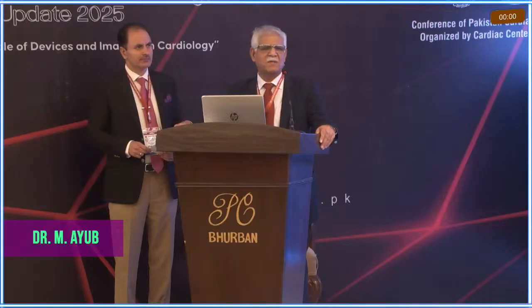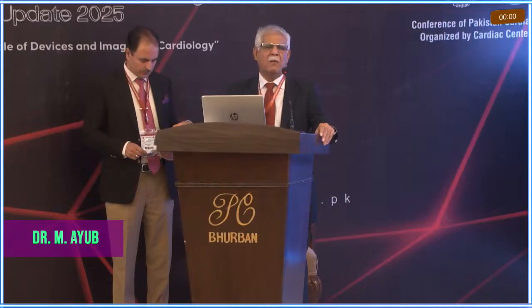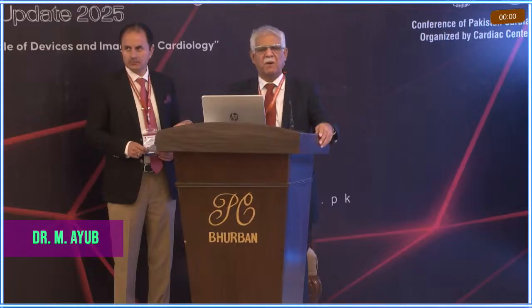Once the patient comes for CTA, no matter how much calcium there is, some people say it should be less than 400, some people say less than 1000, but practically nobody actually stops. Why not?